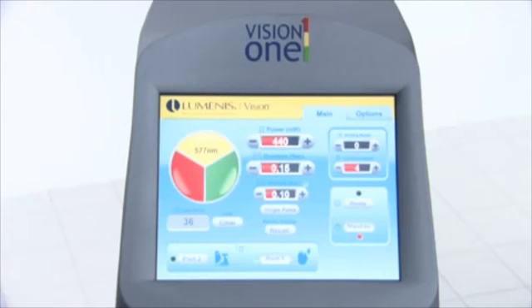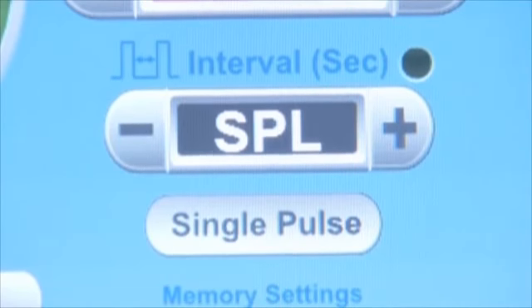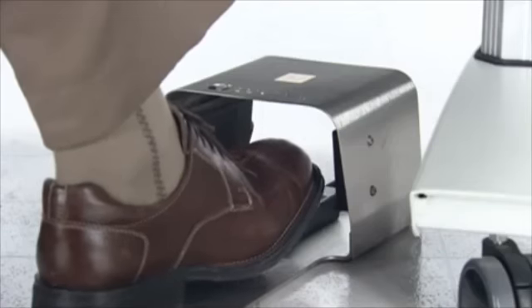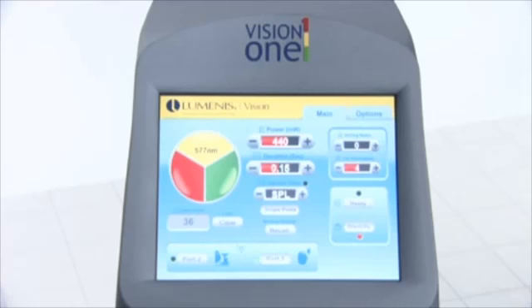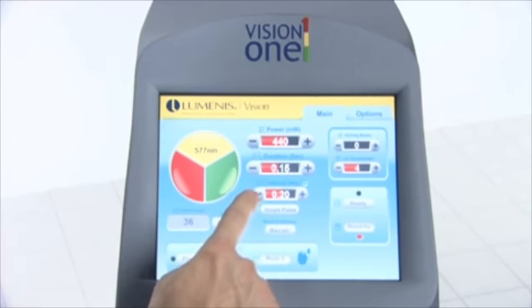The treatment interval is the time in between laser exposures. Single and repeat exposure modes are available. In single exposure mode, the laser delivers a single exposure each time you depress the foot switch. In repeat exposure mode, the laser delivers repeat exposures at a specified interval until you release the foot switch.